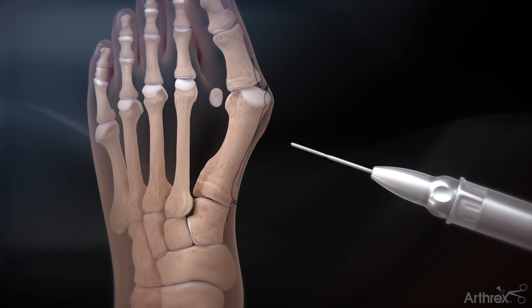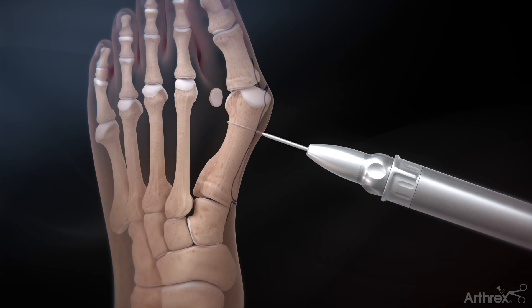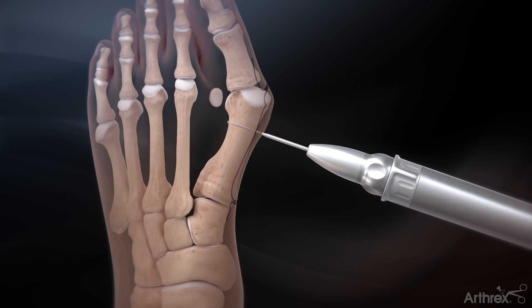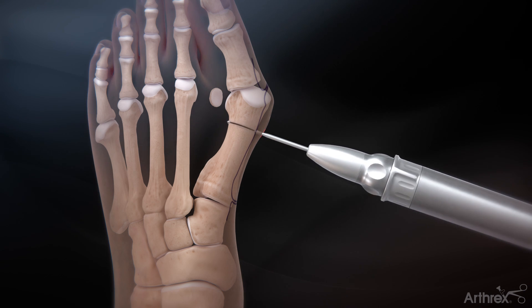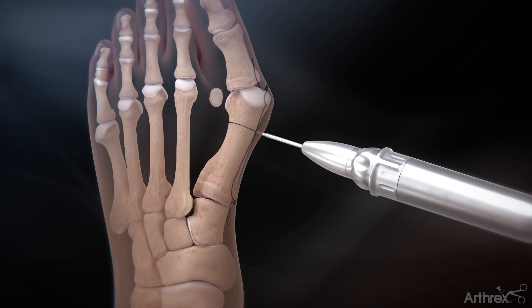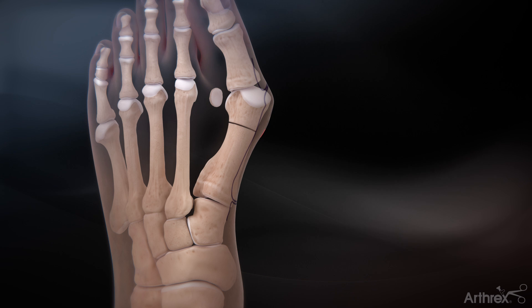Insert the 2.0 by 19.5 mm burr through the incision at the midline of the metatarsal through both cortices. For the transverse osteotomy, complete the dorsal portion of the cut first, followed by the plantar portion. Arthrix recommends continuous use of irrigation while performing the cut.